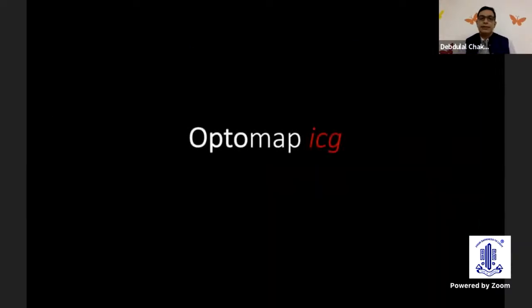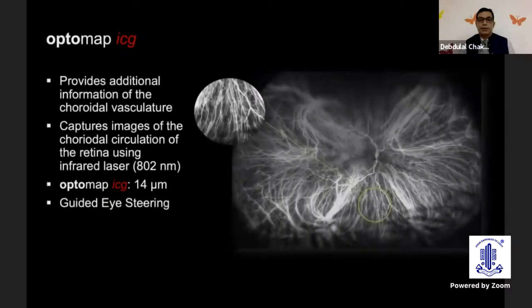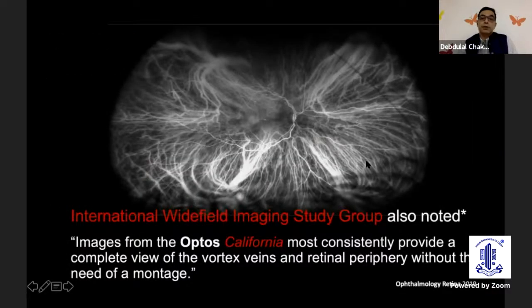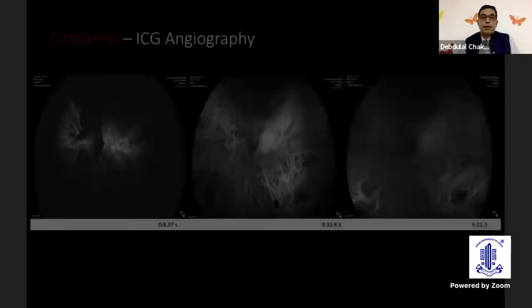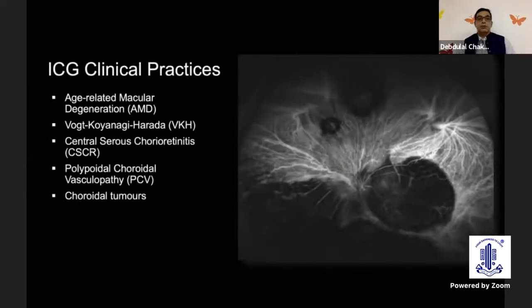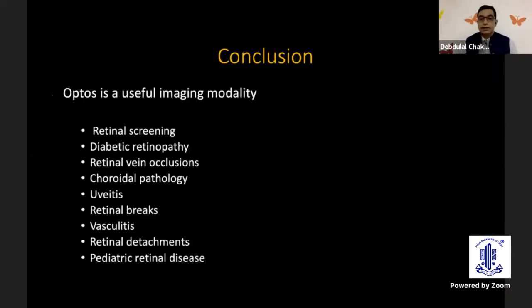The Optomap ICG, like I mentioned, we don't have the California, which actually has facilities for Optomap ICG, but this also is a wonderful tool, and surely we'll be using it shortly. And it can image right up to the periphery, and all four vortex ampullae can be seen. And this has also been noted by the International Widefield Imaging Study Group. So these are images through the California. And of course, it has uses in AMD, VKH, and other diseases.